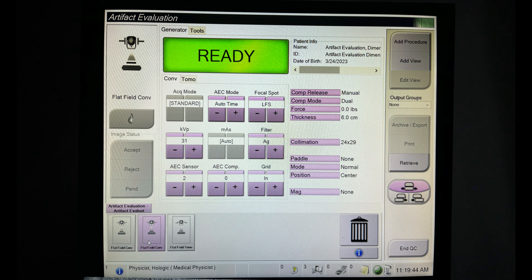Now you should be ready to acquire some images. We'll then select the first flat field conventional field view and ensure that the on-screen techniques are set. After we acquire the exposure, we'll select the actual pixels tab. This looks like the breast overlay on a box. Deselect the information mask series just to make it easy. We'll then pan through the entire image and look for artifacts that pop out at us, such as bad pixels and other sharp lines or demarcations.